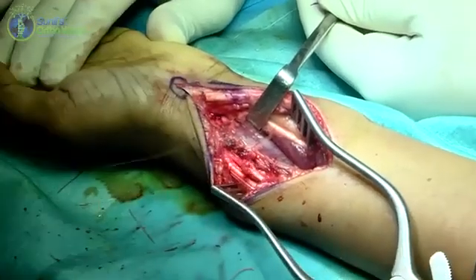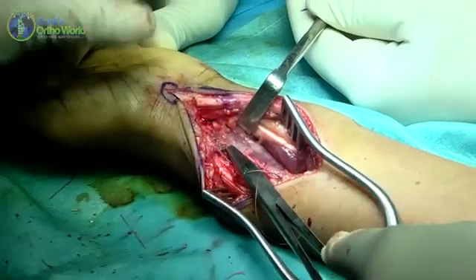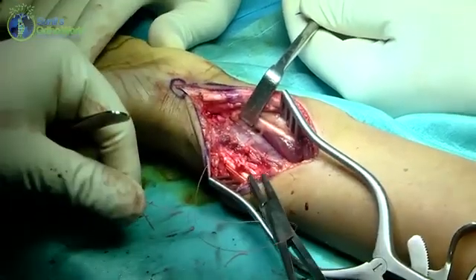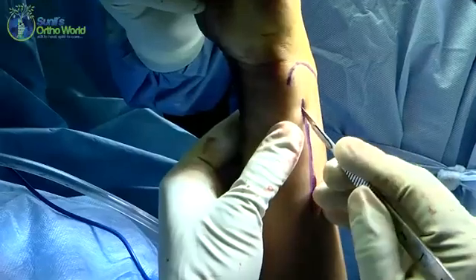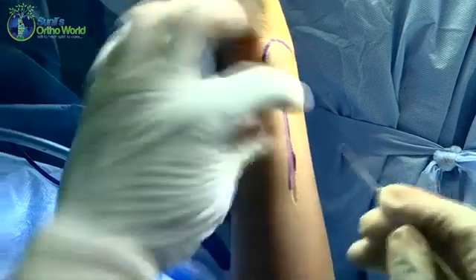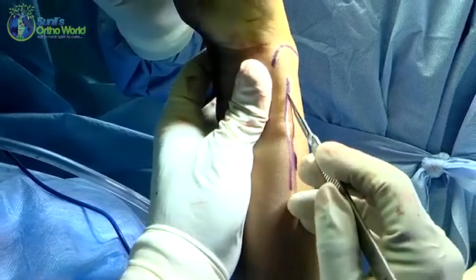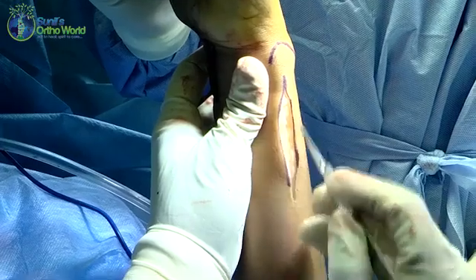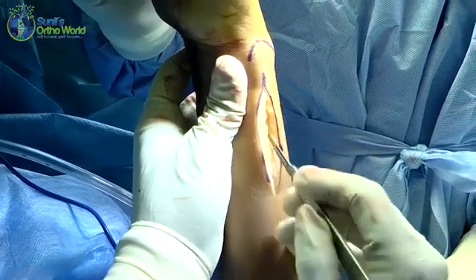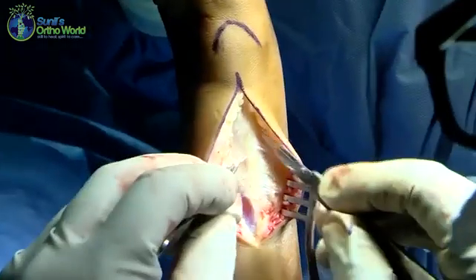The next step is to repair the Z-plasty of the brachioradialis tendon. Once this is completed, the soft tissues are then closed in a layered fashion. As per our pre-operative plan, in this patient we carried out an ulnar shortening osteotomy.